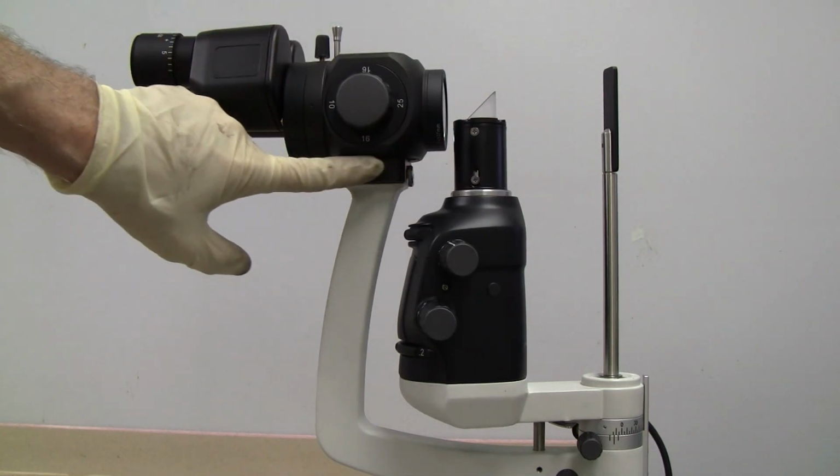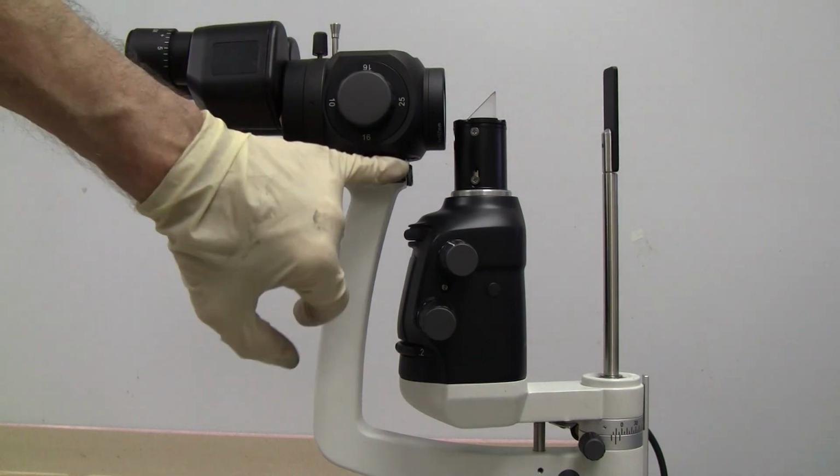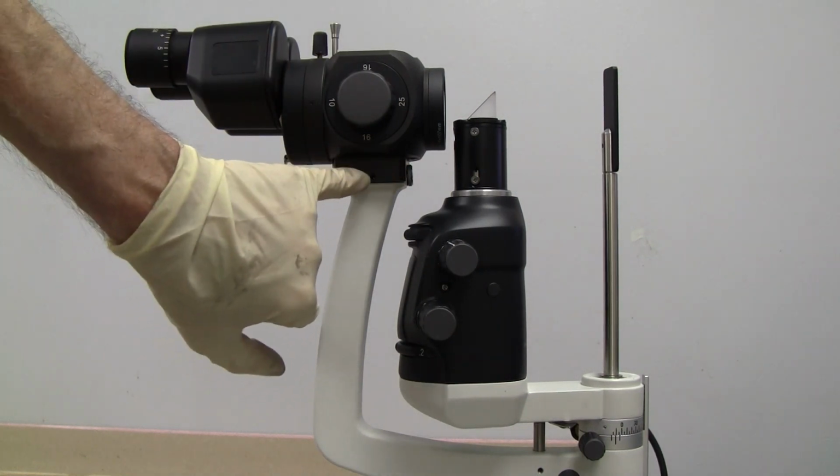Now on your head, some have a screw with a knob, but this one only has an Allen, and you'd have to loosen the Allen wrench to adjust the focus of your light on your test bar. If you had to move it one way or the other a whole lot, then you would probably have to slide this out and move the mount.